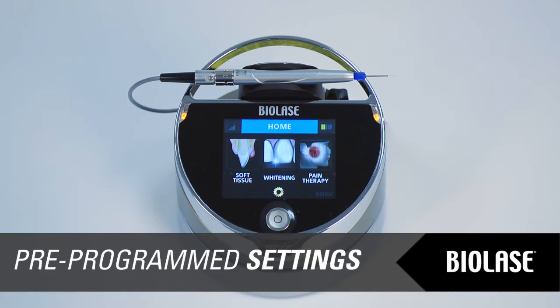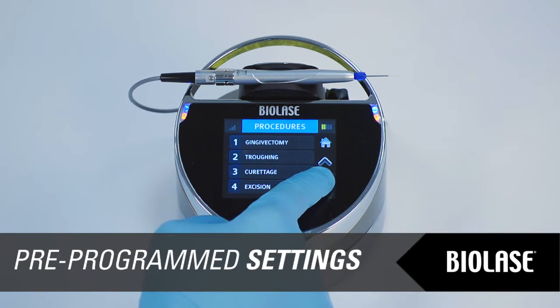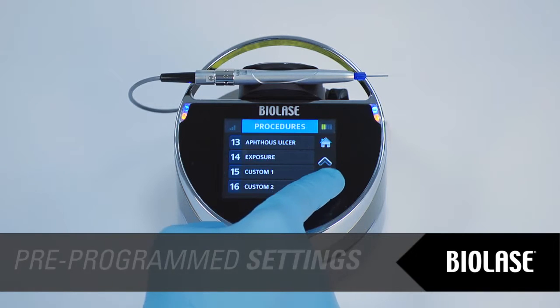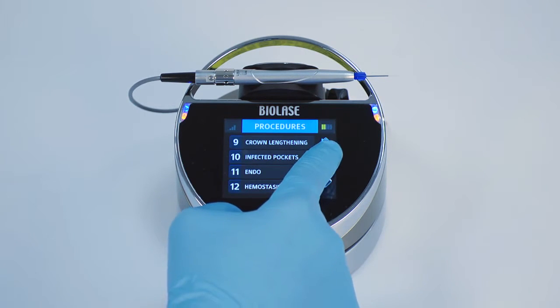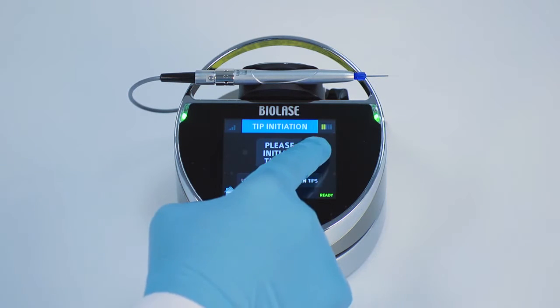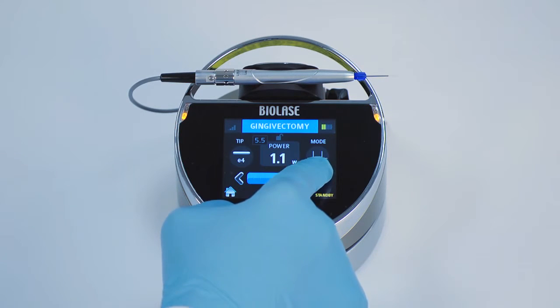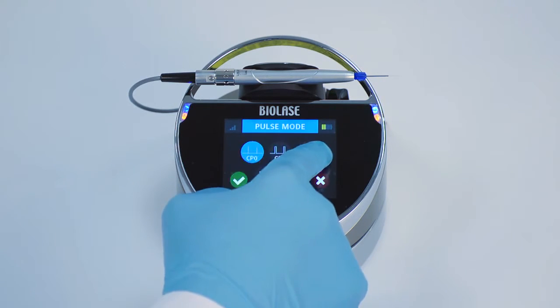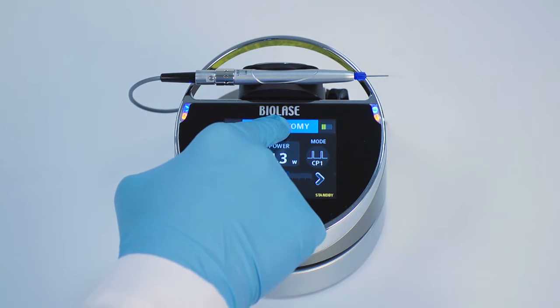The Epic has the ability to store up to 20 preset procedures for soft tissue surgery. It is factory installed with 14 pre-programmed procedural presets and 6 empty slots for custom presets. To select a procedure preset, scroll through the list and tap the procedure you wish to use. To store your personal preferred setting for any procedure, scroll to the procedure you wish to customize. Enter the new parameters, then press and hold the procedure name for 2 seconds. You will hear a beeping sound confirming the settings are stored.